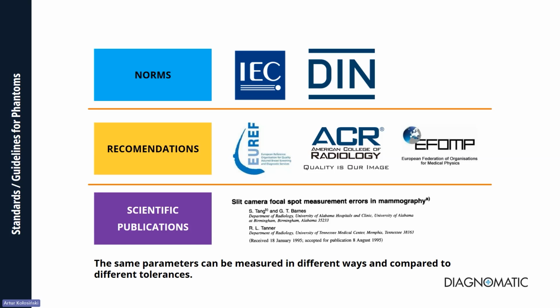Moreover, if we don't find anything in the norms or guidelines, we still have scientific publications in different journals, or posters or abstracts from conferences. So they also describe how we can perform the tests and what we can do.